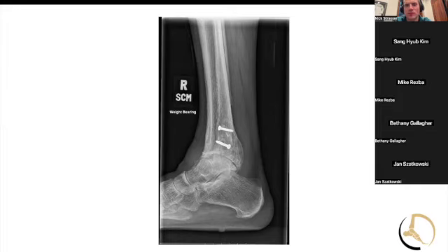Okay, so you would accept the deformity. Yeah, I would, to keep her MIS. I've gone past the deformity already. So you would leave it a little bit anteriorly translated. Yes, a little plantarflexed. I think to get it posteriorly, you would have to do this open. I don't think you can do that percutaneously or MIS. Maybe there's someone who's very facile in it, but I think it'd be extremely difficult. So I just kind of fuse it where it lies.